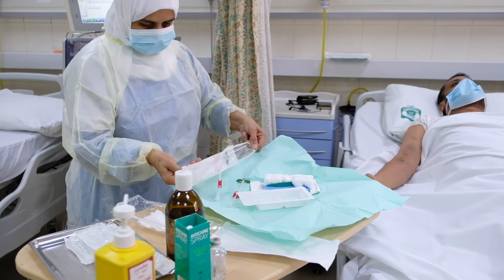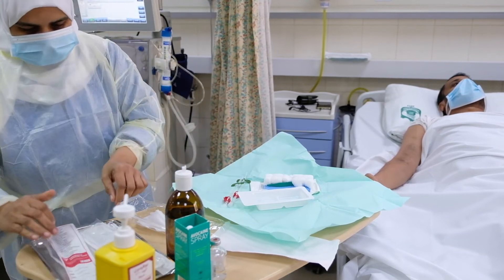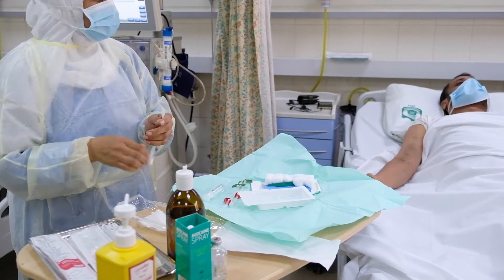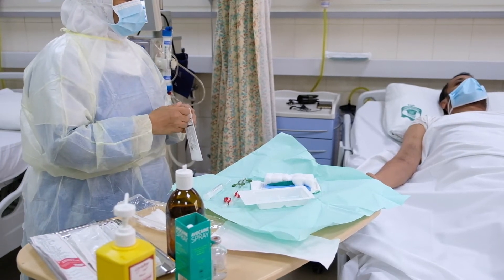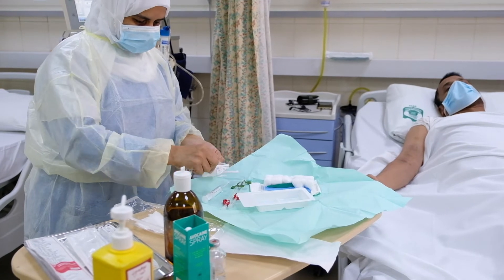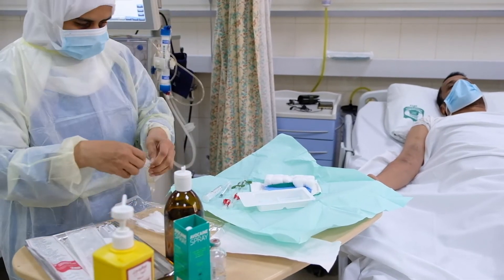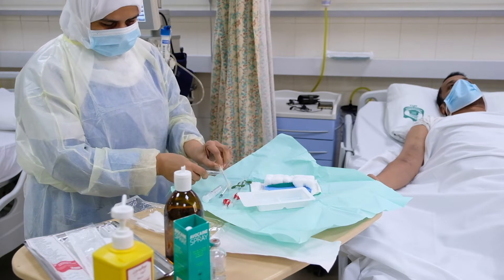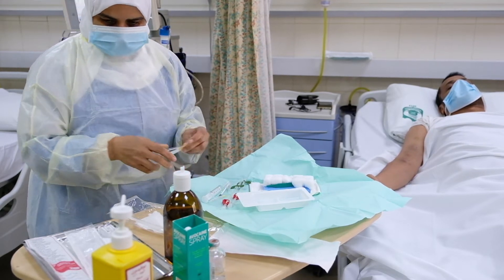Open fistula needles with the required size according to the patient's AVF fistula maturation and access time. Keep a 10 ml syringe with heparin. Open sterile gloves. Put out a 1 ml syringe for local anesthesia if required.